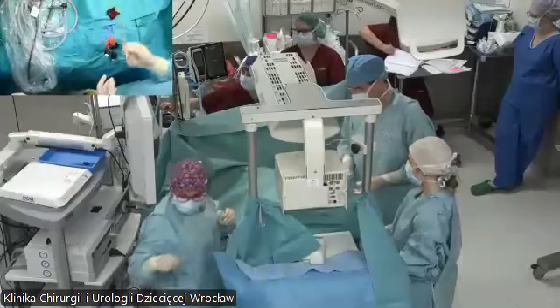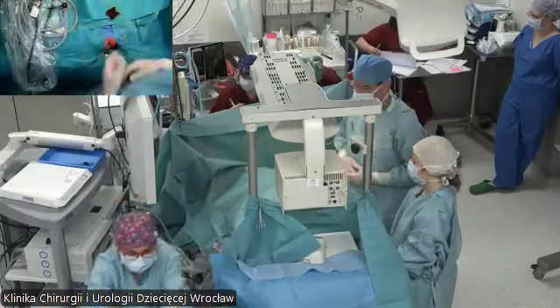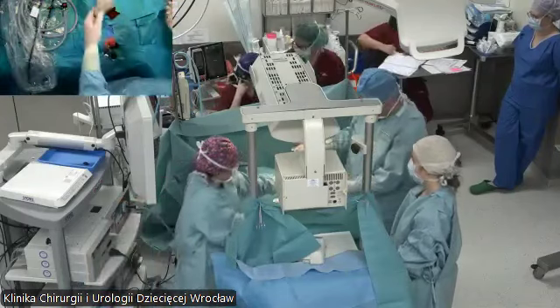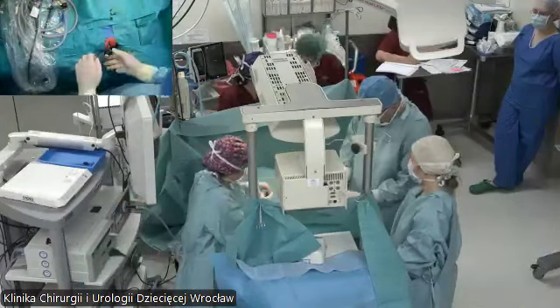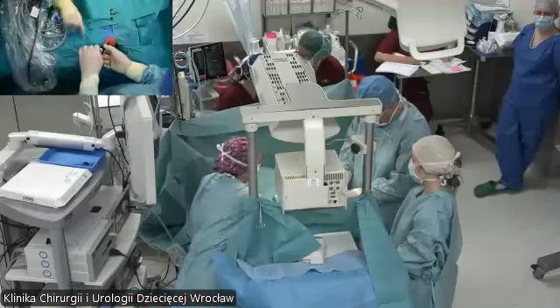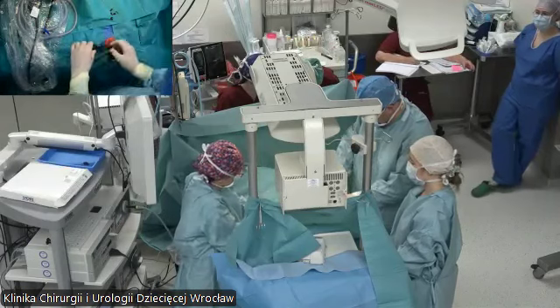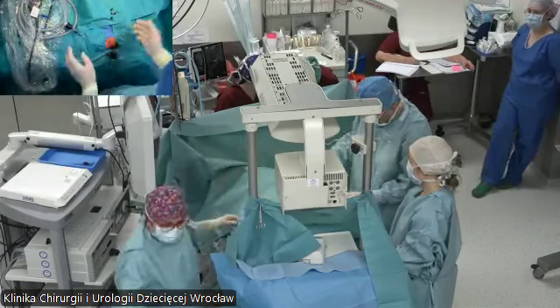May I have a drain? So this is why I ligate it, you know? Because anyway, even if I want to put a clip, I have to dissect the fistula around. So for me, it makes just 1 minute more for the procedure. So this is why I ligate it, okay?